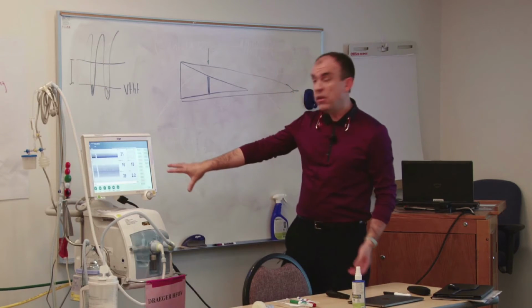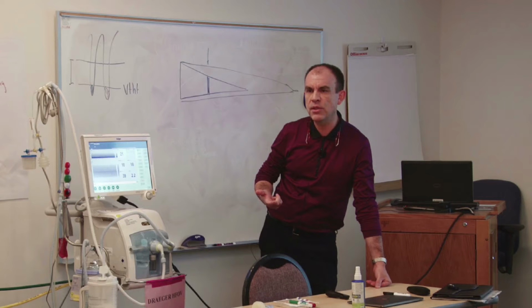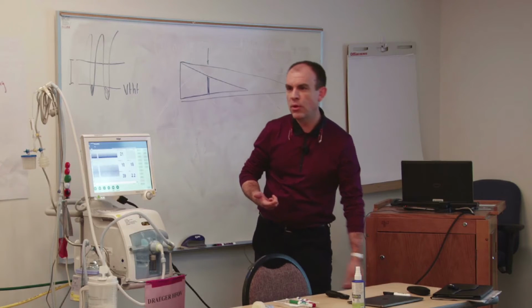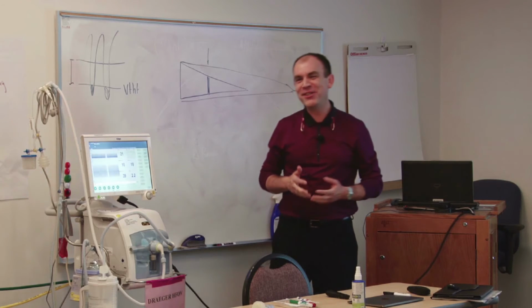For us, using this ventilator has a huge advantage. You don't de-recruit the lung when you're trying out a patient in high frequency. And you're not troubling the nurses either, which for us is a huge thing.